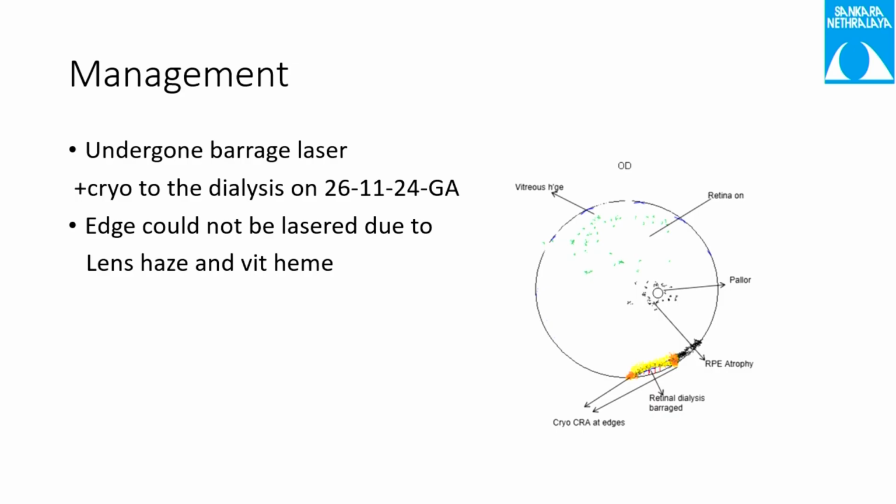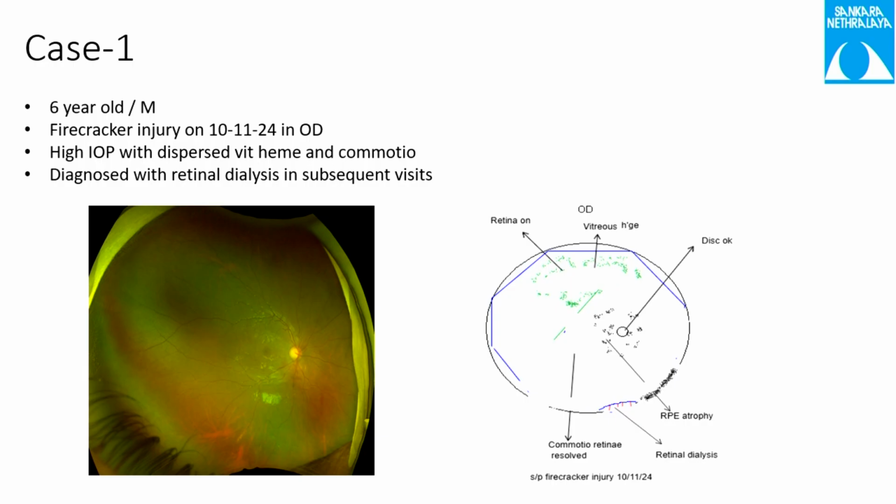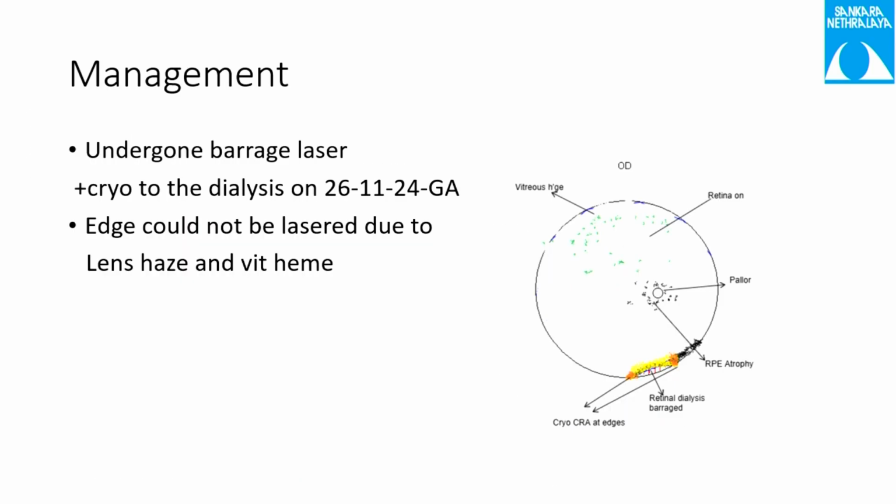Since he was a child, the patient was taken up for barrage laser under general anesthesia. Since the edge of the laser could not be connected to the ora, the patient underwent cryotherapy to the edges so that the laser marks are connected to the ora serrata.